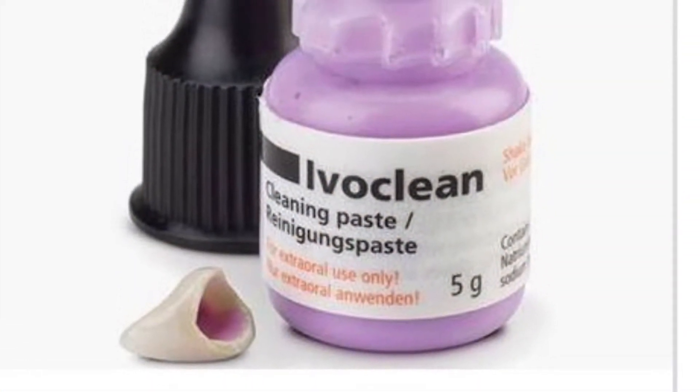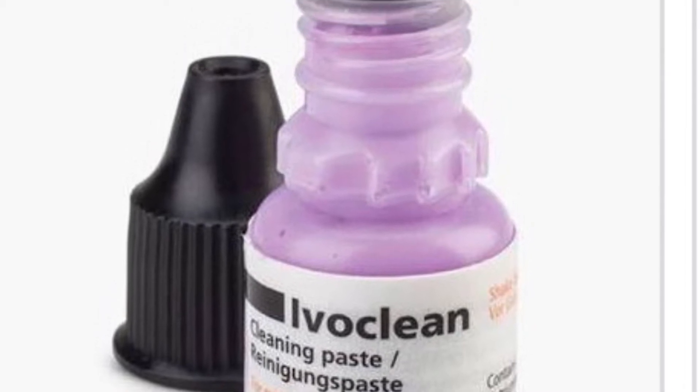Remember, saliva chemically bonds with the zirconia crown and cannot be removed by just rinsing with water. You can clean it with a commercially available product called Ivoclean.